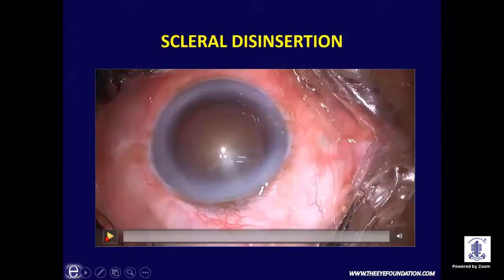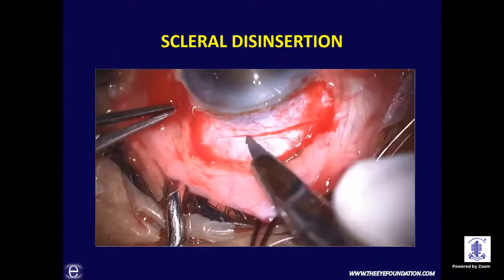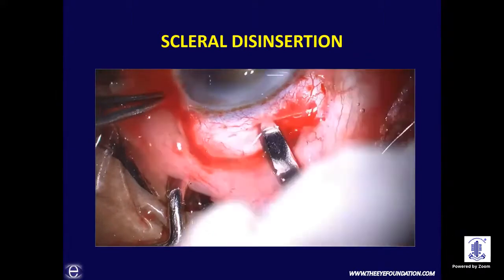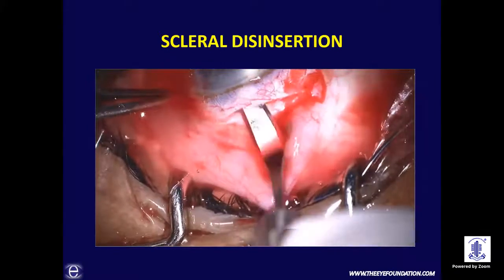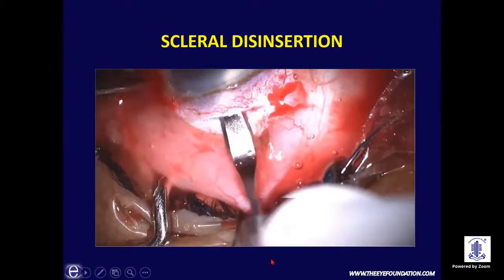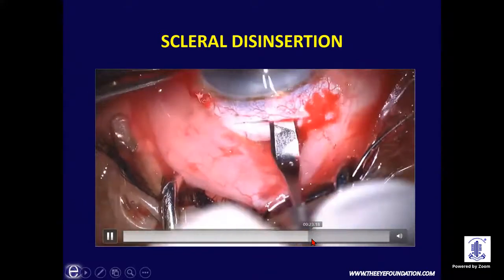Scleral disinsertion, though rare, whenever we are making a groove, always make sure that it is done in one step. So here the surgeon is deepening the groove multiple times, even with the blade and also with the crescent tip. And while doing the sclerocorneal tunnel, the surgeon is having a little suspicion that the AC is a little shallow, but with hesitation, the tunnel is being continued.